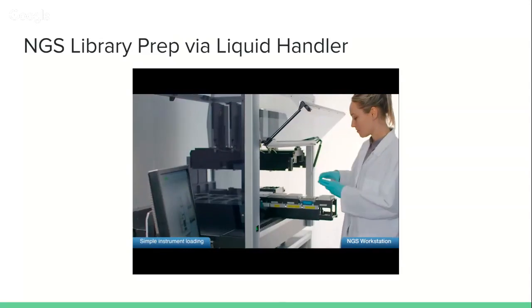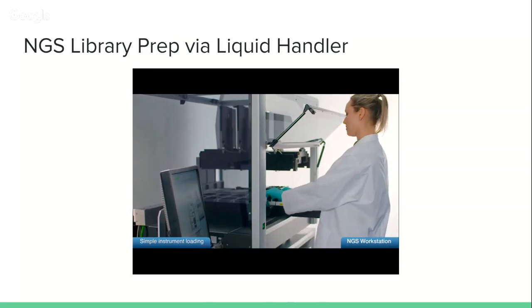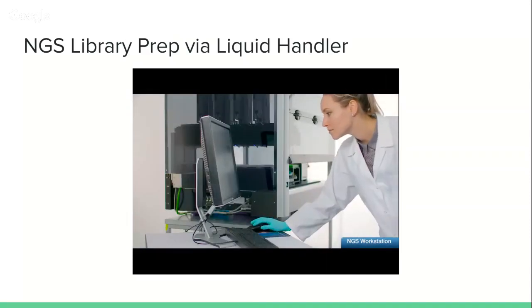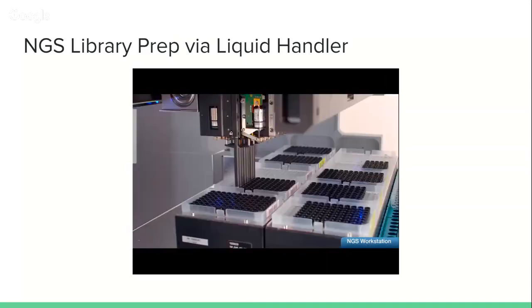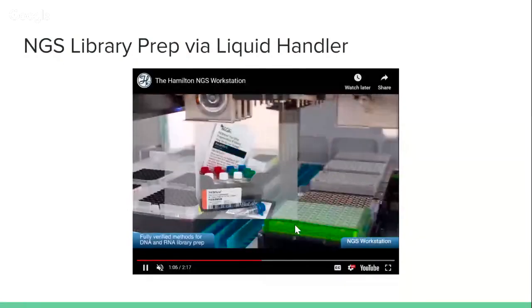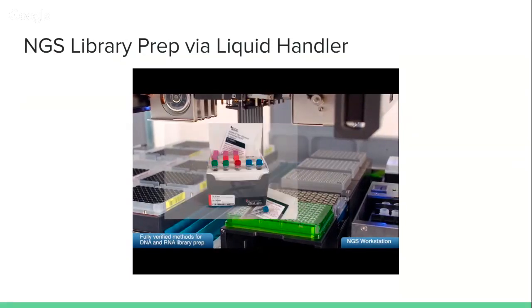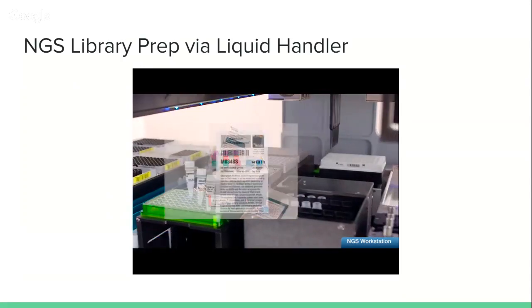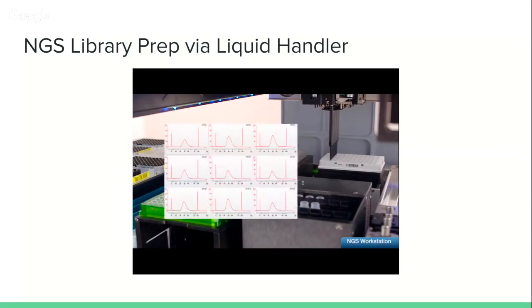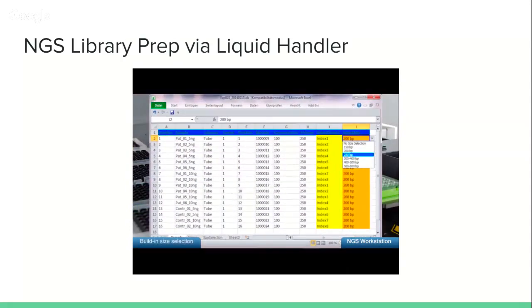There are different library preps for different applications. For example, the ones that don't do any PCR, simply PCR-free, they just add the adapters and pool them, or other ones that do PCR amplifications at different steps. Most of these machines have a very nice ratio of hands-on time versus total assay time, in the sense that even if they take several hours or over a day to run, what's important for scalability of the process is that they work all the time, but also that they have a relatively low hands-on time requirement, right?